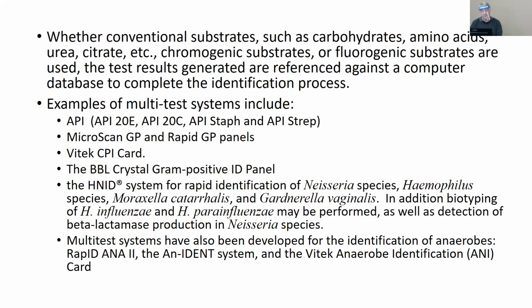We use gram stain. We use Haemophilus and Neisseria ID panels to identify Neisseria and Haemophilus.